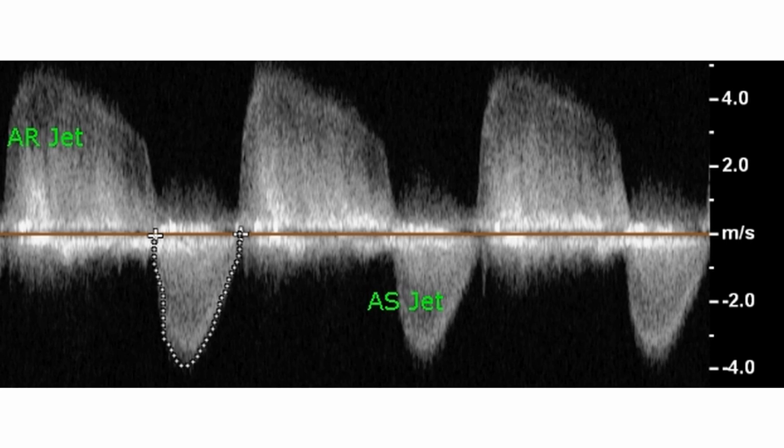Pulsed Doppler is not useful for this study because the velocities are much above the aliasing limit of pulse wave Doppler.